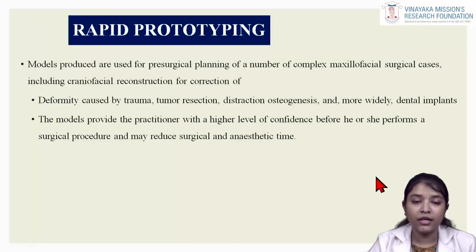Rapid prototyping: models are produced from this CBCT, where it can be used in pre-surgical planning of a number of complex oromaxillofacial surgeries. It helps in deformities like trauma and tumor resection, and it provides the practitioner a higher level of confidence before performing in the oral cavity.